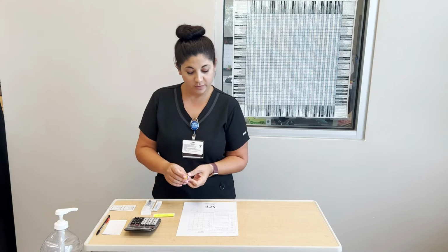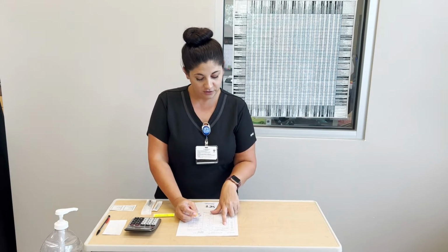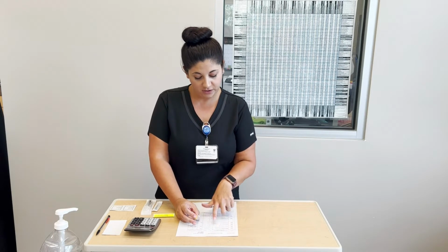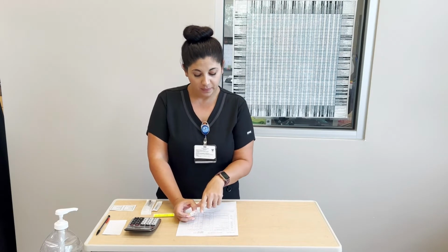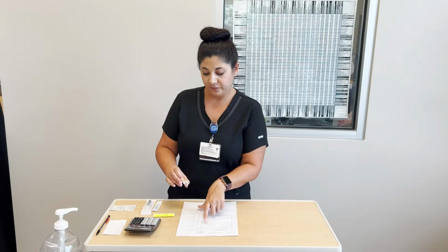Then I will do my second check of the medication, stating the name of the medication on the MAR and the name of the medication on the vial, the dose of the medication on the MAR and the dose on the vial. The route is IV or IV push, checking that the time is correct and the frequency is correct.